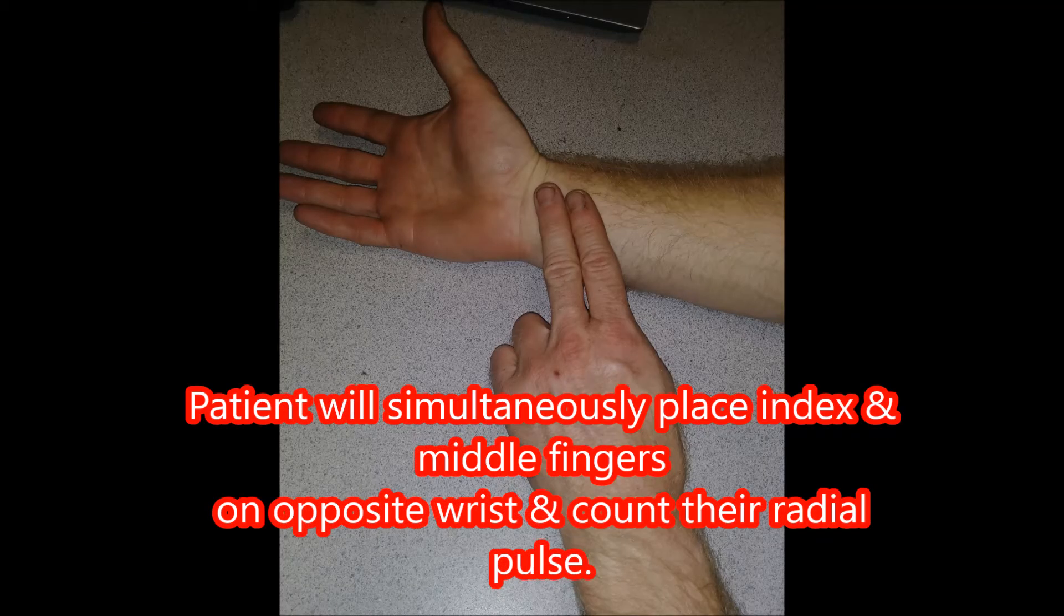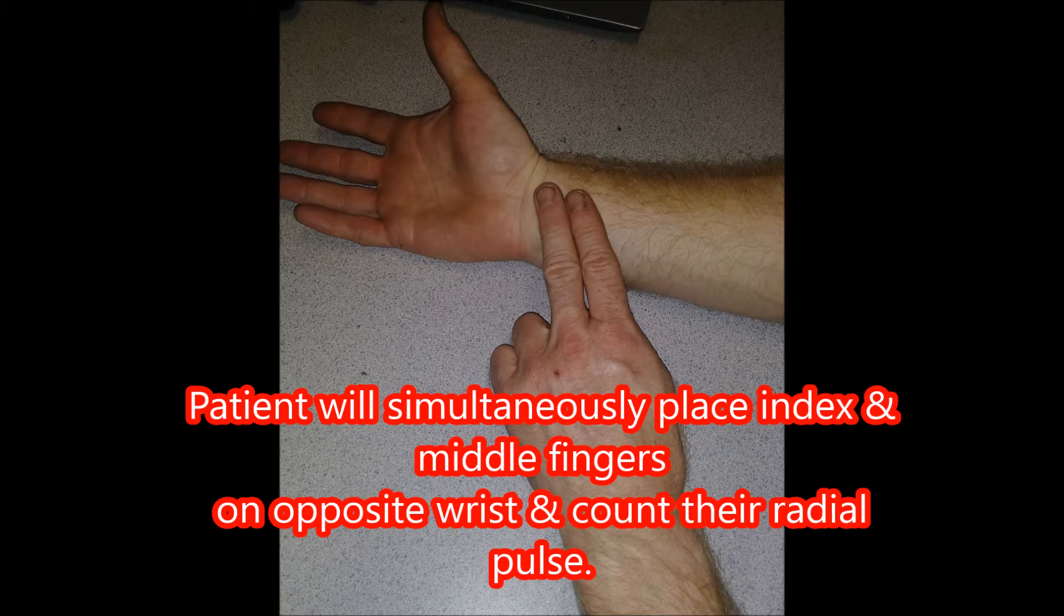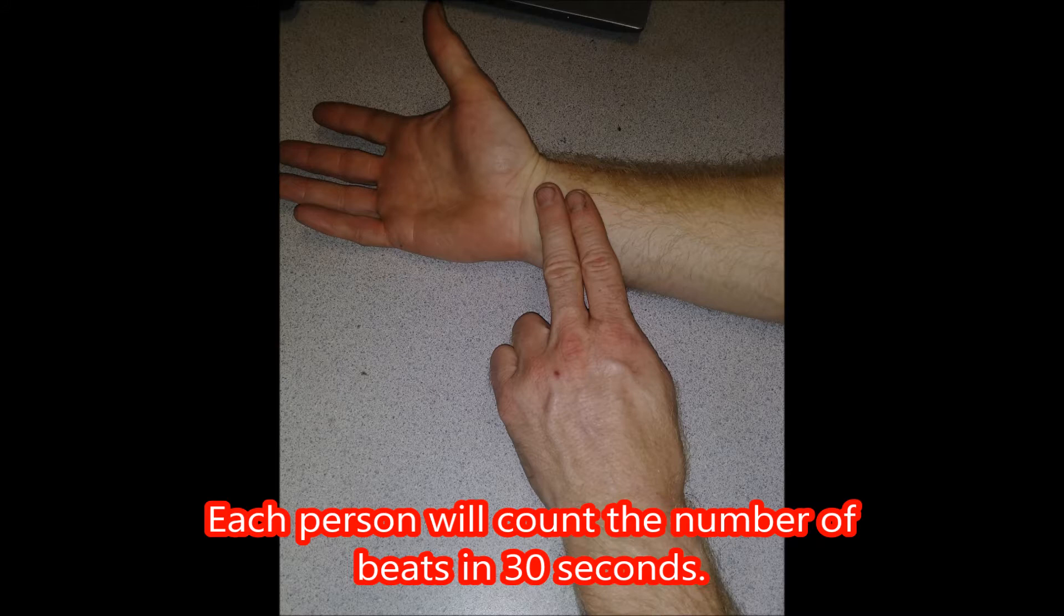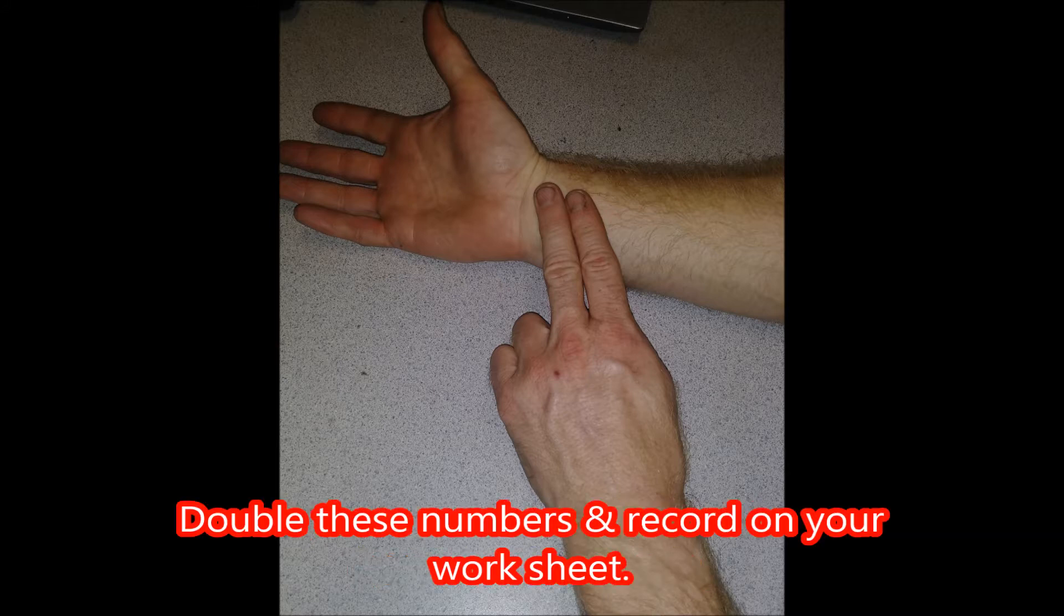The patient will simultaneously place index and middle fingers on opposite wrist and count their radial pulse. Each person will count the number of beats in 30 seconds. Double these numbers and record on your worksheet.